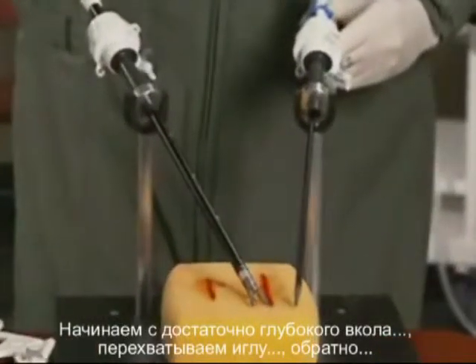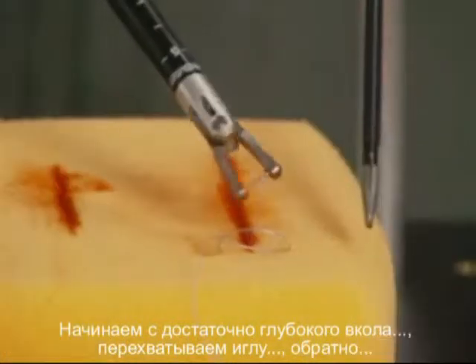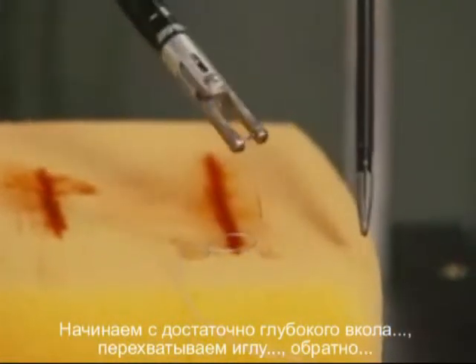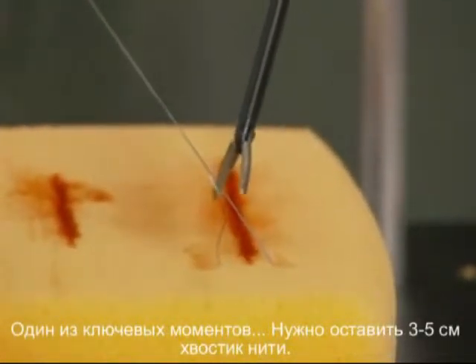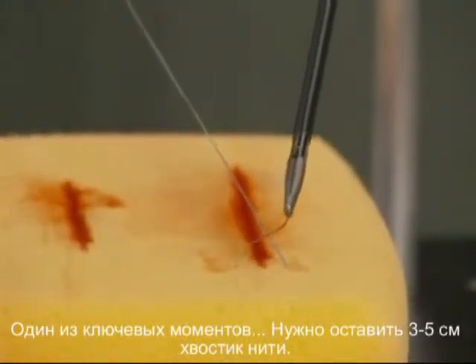Now we're going to start off by taking a nice deep bite of tissue. I'm going to toggle — that means transfer the needle. One of the key steps is pulling the suture back so you have about one and a half to two inches of suture on your tail.